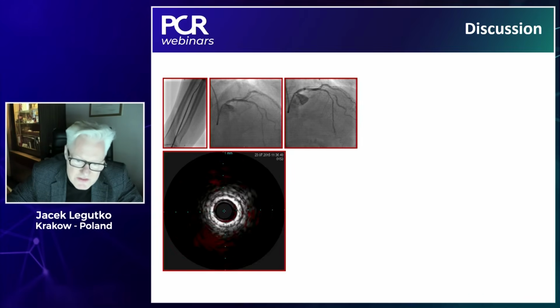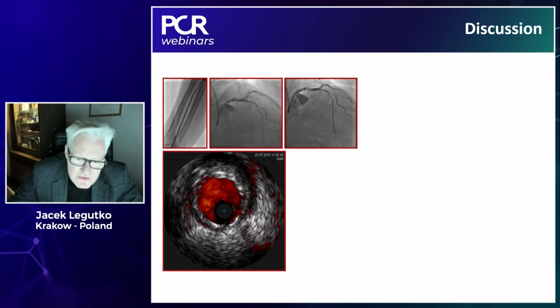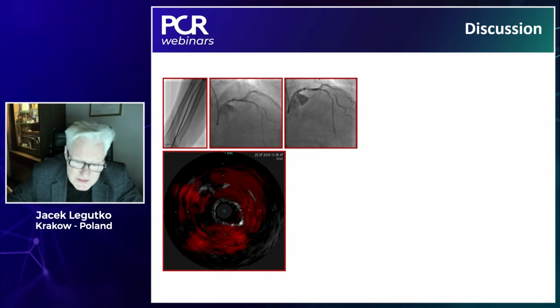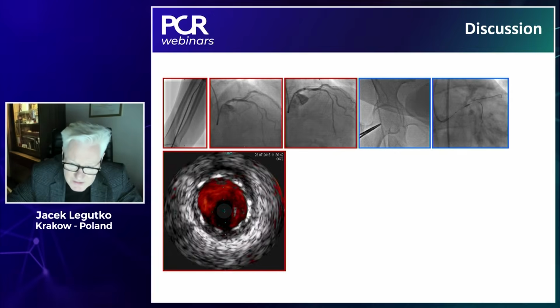If you don't recognize this, and if you go with the balloon and inflate the stent, the balloon in the LAD, and then during the removal of the balloon, you can even withdraw the stent from the left main. Such cases are in the literature, you can find them.